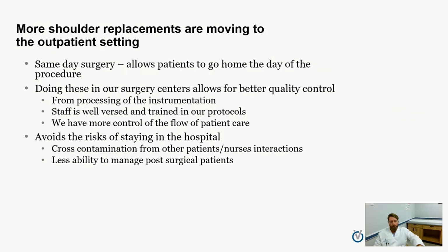What's new in 2024 is that over the last several years, we're doing more and more of these surgeries on an outpatient basis. So you're coming into the operating room in the morning, you're getting your procedure done, and you're going home at night. We're able to do this for lots of reasons. One is the technology has gotten better with shoulder replacements. So we use instrumentation that's more specific to patients and that's easier for the OR staff to utilize.